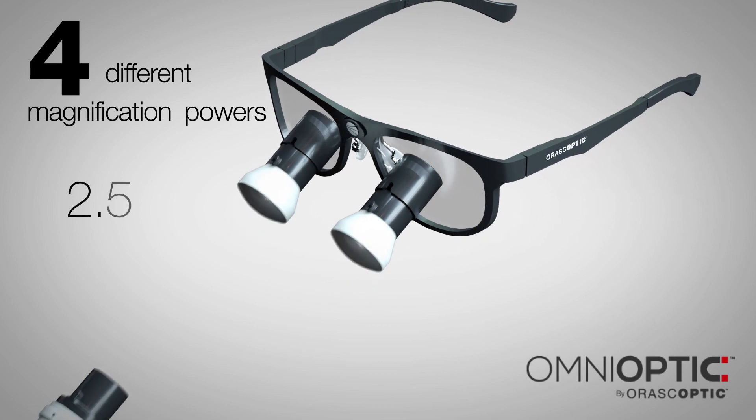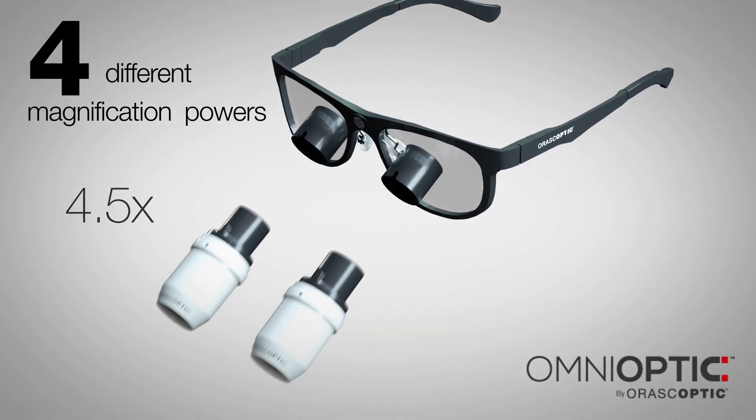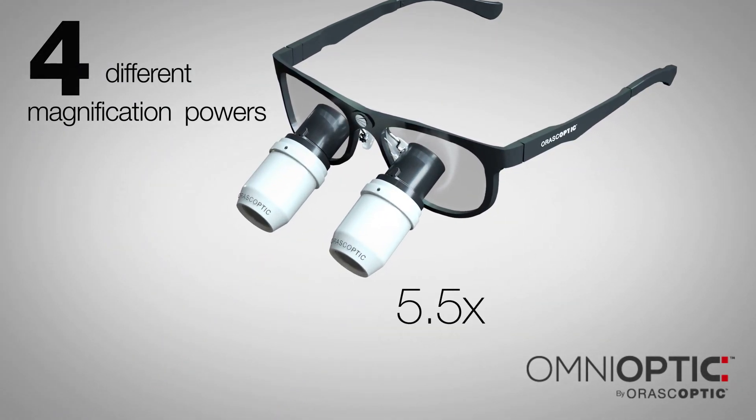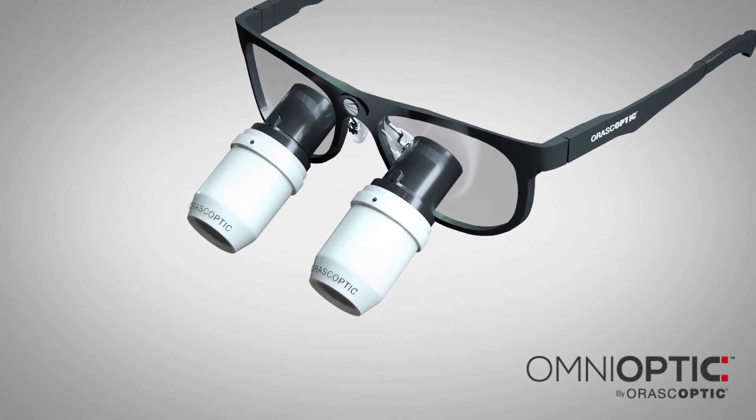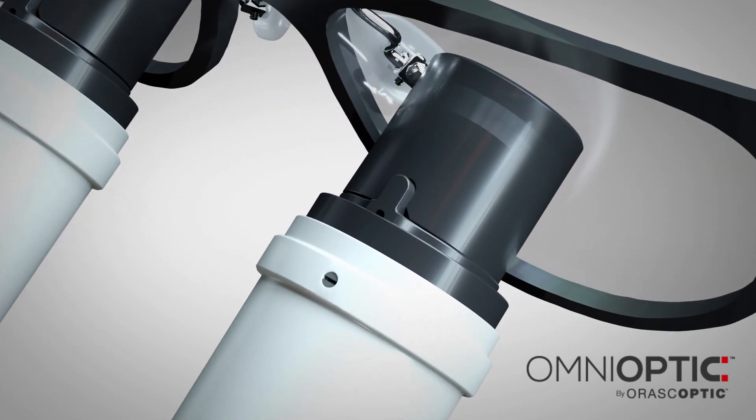2.5 times, 3.5 times, 4.5 times, and 5.5 times. Magnets seal the telescopes in place and let the user quickly and easily slide the telescopes in and out of the frame.